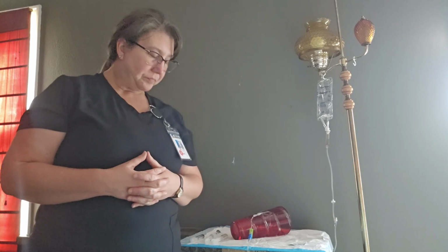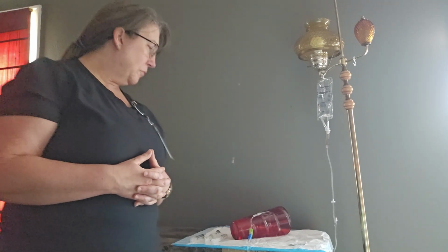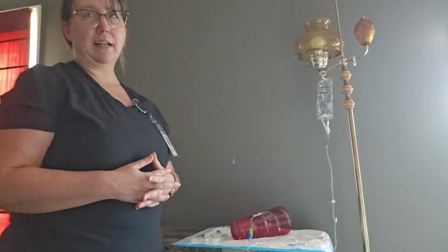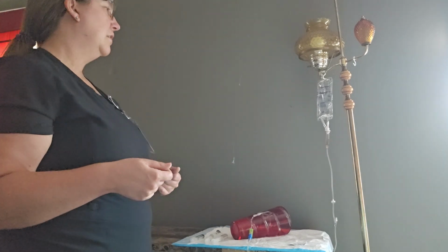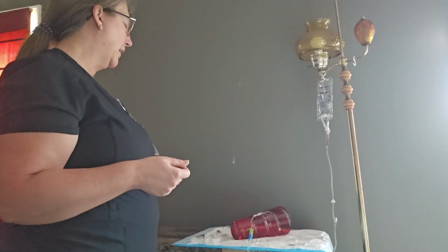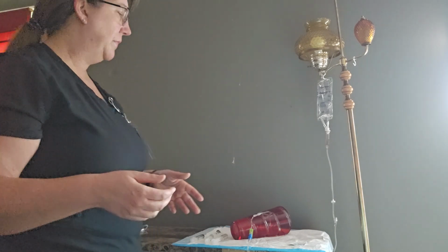But at this time, I am also going to do my calculations, because depending on what medication it is depends on the rate at which you're going to push that medication into that IV. I will also be starting my 3 safety checks at this time, like I previously stated. So we're going to take our equipment and our supplies, and we're going to go see our patient.